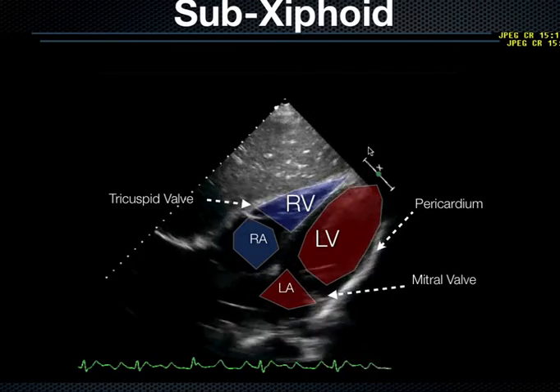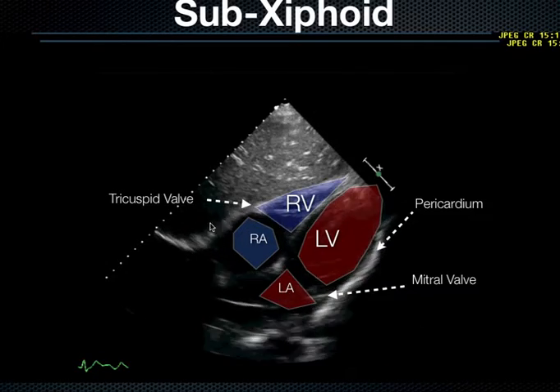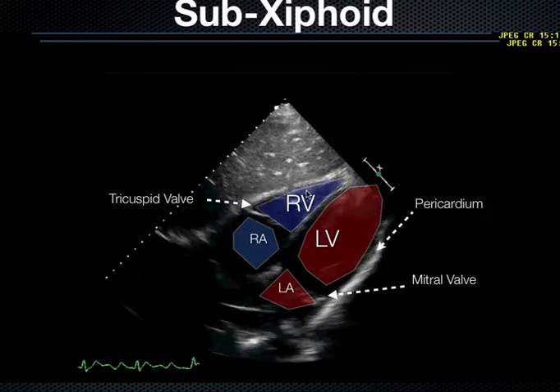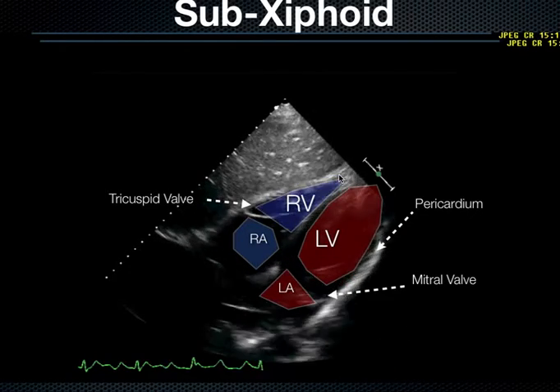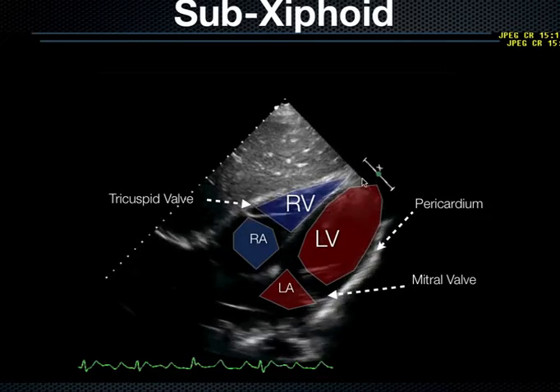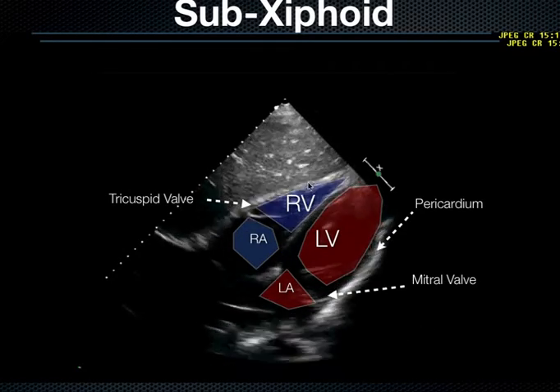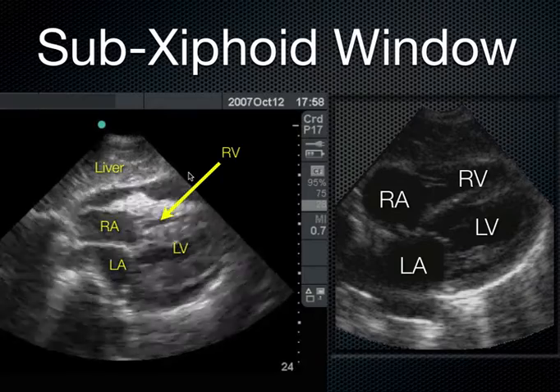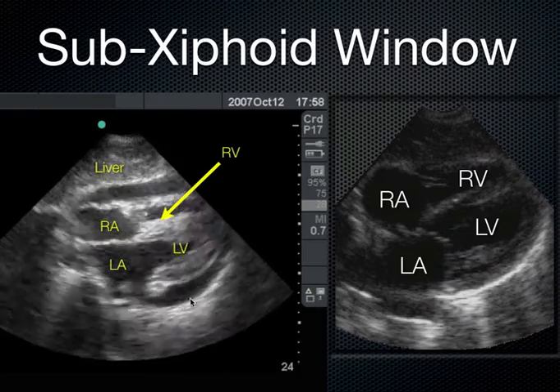The second thing I use this for is for pericardial effusions. This is the best view, the most sensitive view, to check for somebody having a pericardial effusion, or fluid between the myocardium and the pericardium. You see, in a supine patient or somebody lying flat, the heart is heavy, and it sits in its posterior pericardium, squishing any fluid anteriorly. And so this is exactly where you see these pericardial effusions, right along this anterior area, like we do here.